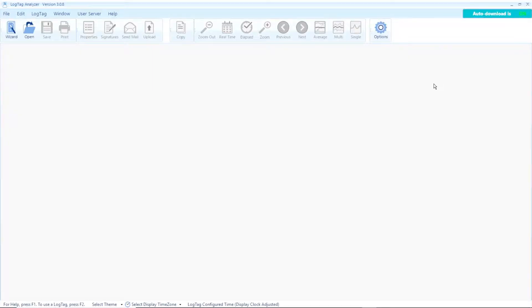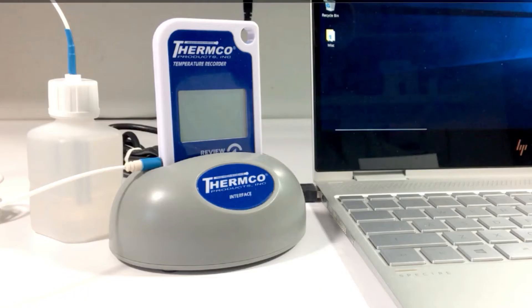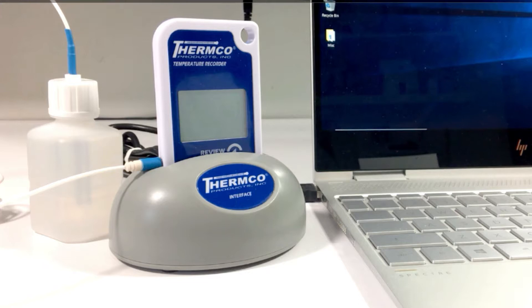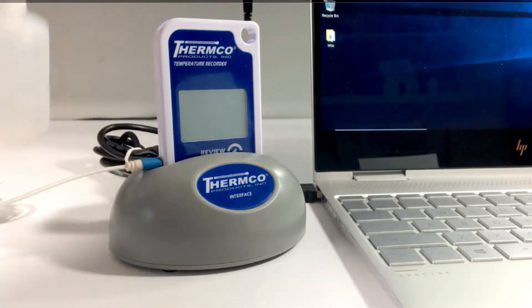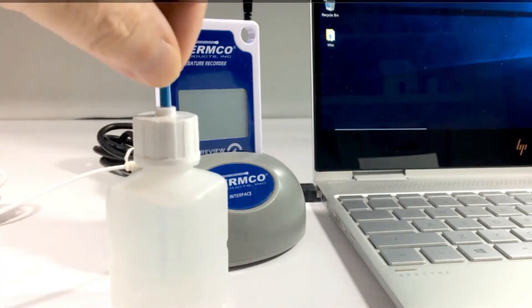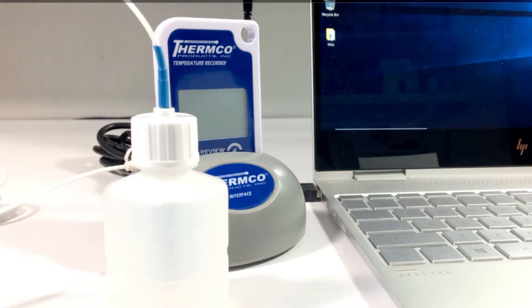Now we completed configuring the log tag logger. Let's close the application. At this point, it should be noted that the sensor buffer bottle should be placed in the storage unit that is going to be monitored for approximately 30 minutes to an hour prior to logging data.